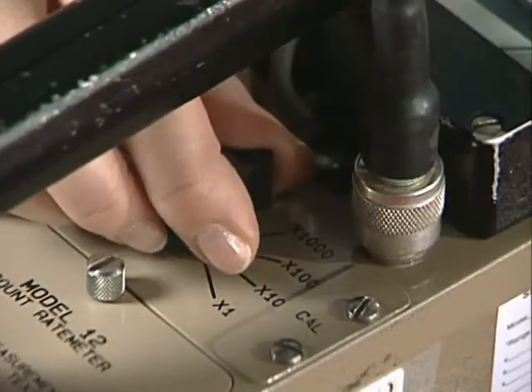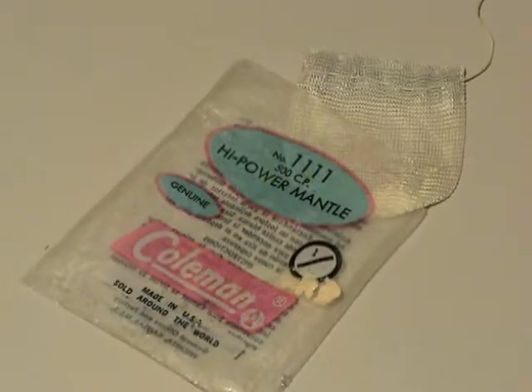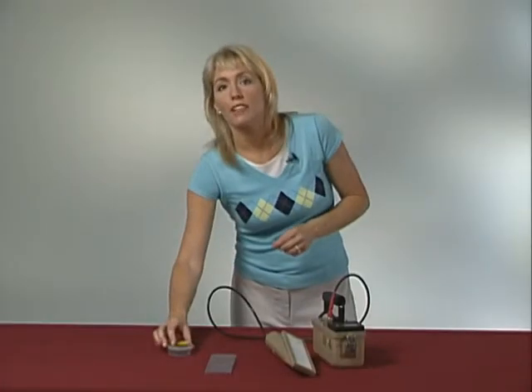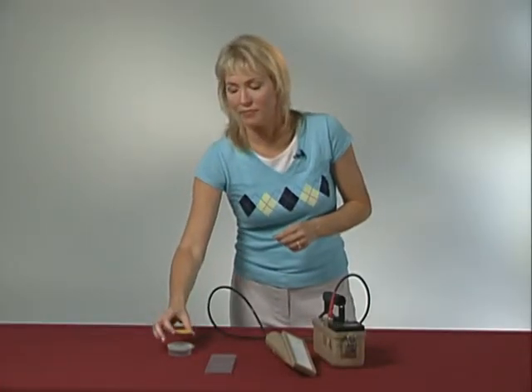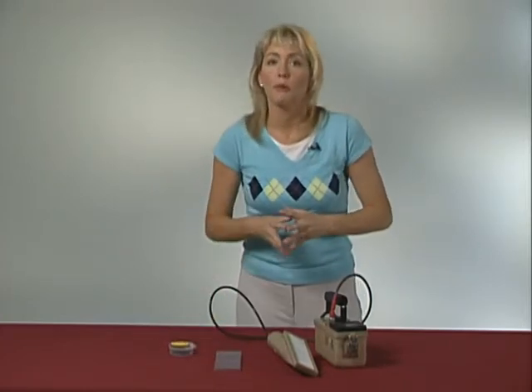Next, rotate the knob to the appropriate scale and determine the instrument's response to a check source. As I mentioned before, a thorium-containing gas lantern mantle or a plastic button check source can be used here. When checking the alpha scintillator, be sure to remove the plastic cover from the probe, and if the check source is in a bag, remove it — because alpha particles cannot even get through a piece of paper.